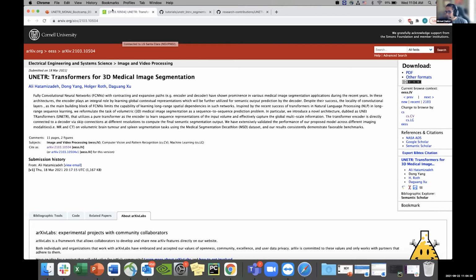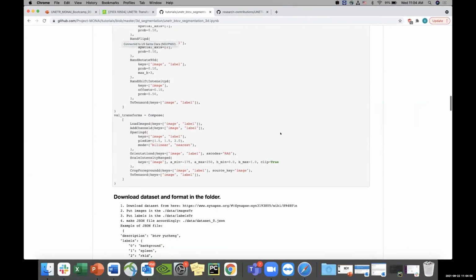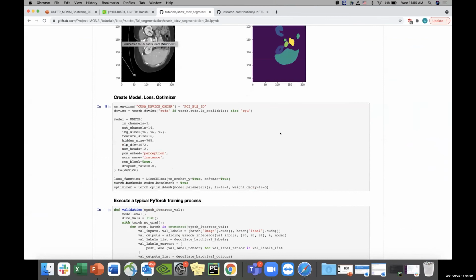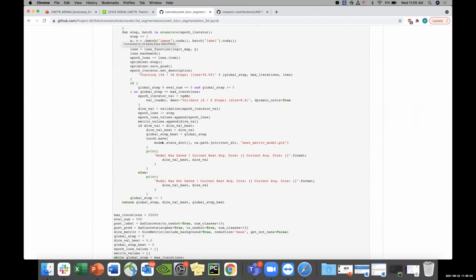Great. There was one here that said there were lots of examples on how to train UNETR, but they couldn't find an example of how to use the trained model to make a prediction. For example, how to save the output the correct way to have an output with the same properties as the input. Does the tutorial that we have go through that? Do you want to show that off? Yes, here we briefly show something about saving the model. Once you create the model, we just save the best model on the validation set, right? Since you're saving the state dict, with the same token, you can also just use torch.load and load this state dict explicitly. But it's a good suggestion.